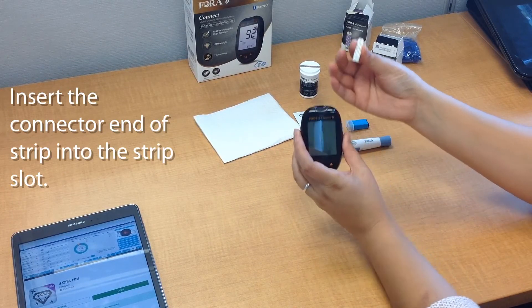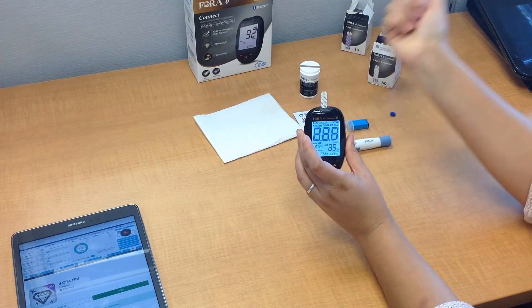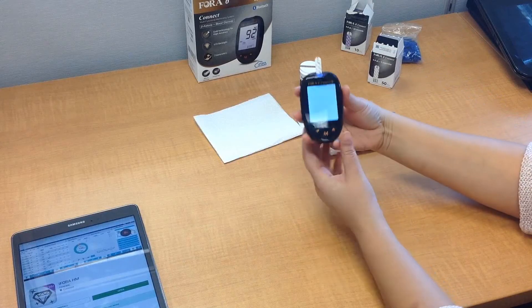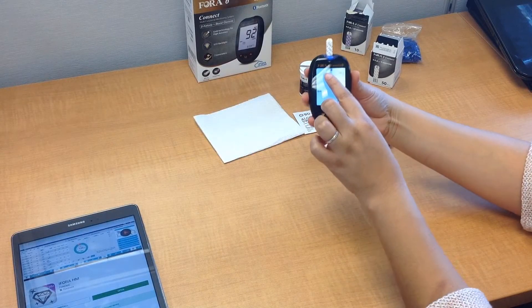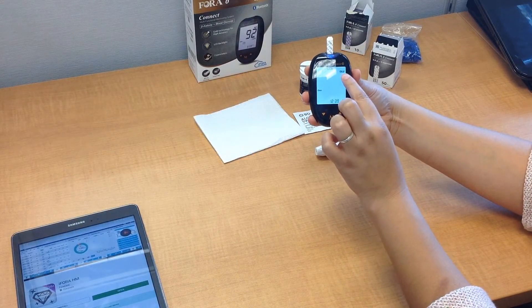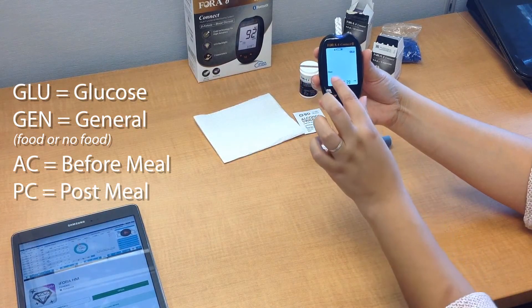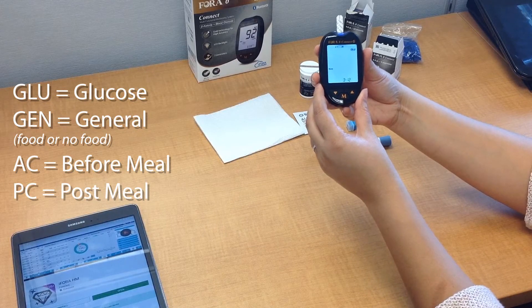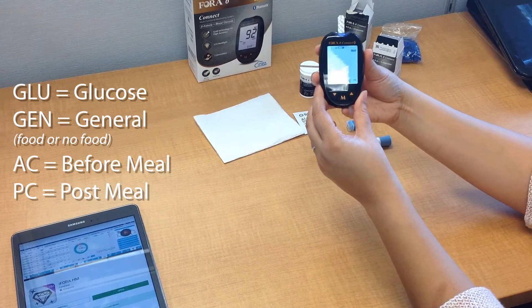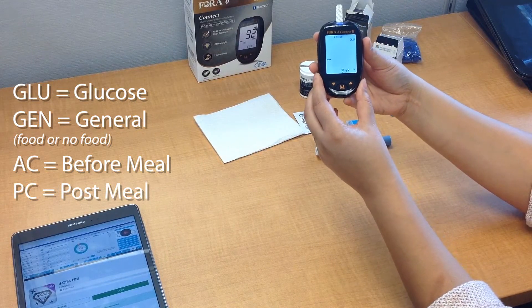Go ahead and take the strip facing up and insert the connector end into the device. That will turn on the device automatically. You'll see a blinking blood drop on the screen along with the letters GLU, which stands for glucose test. You'll also see the letters GEN on the screen, which means that the testing mode is general — no regard for whether you've had a meal or if you're fasting, whatever your situation may be.